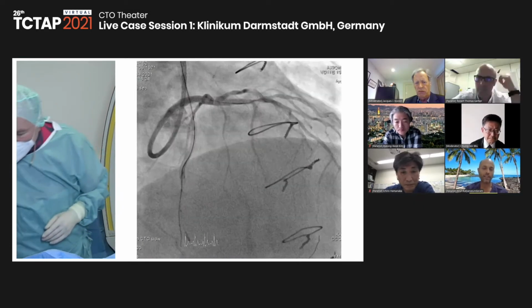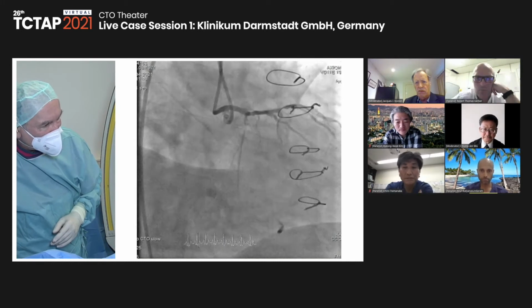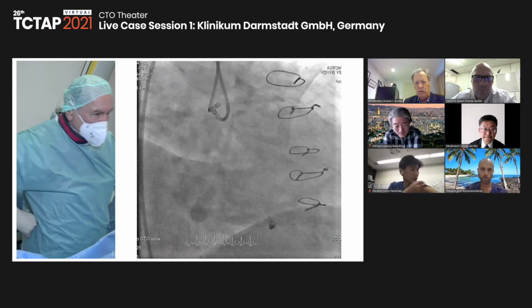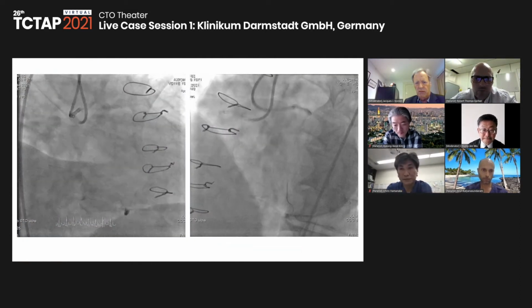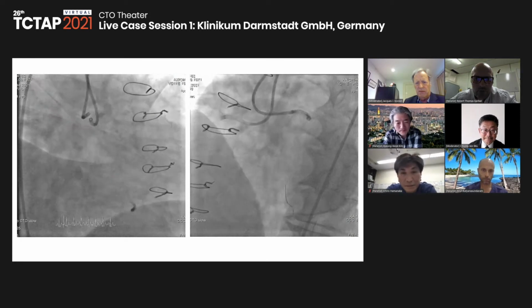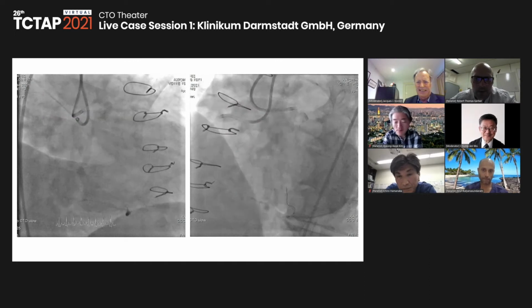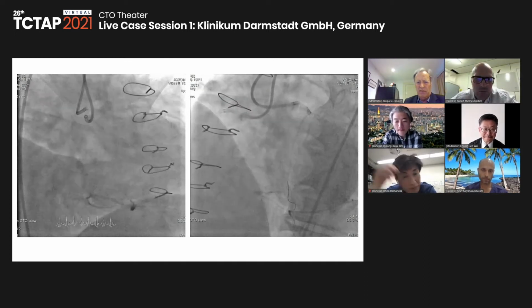No, you don't have. Well, then I would do exactly. I will show you. I did some shots here. Here, this is a shot on the landing zone. I think you are the master. You might find a landing zone, but not for me. I don't find a landing zone there. I have a small notch, which is helpful if I get inside from retrograde, I think.